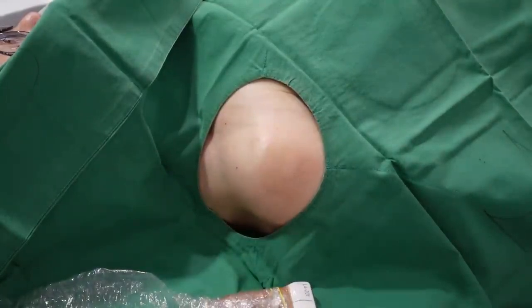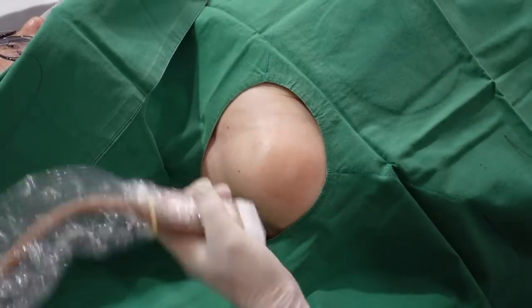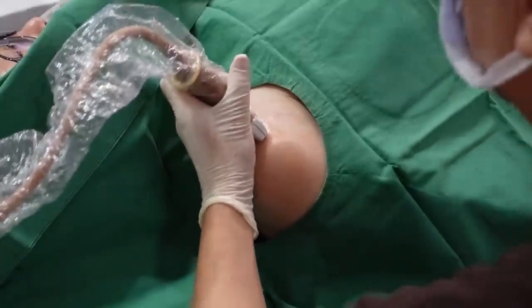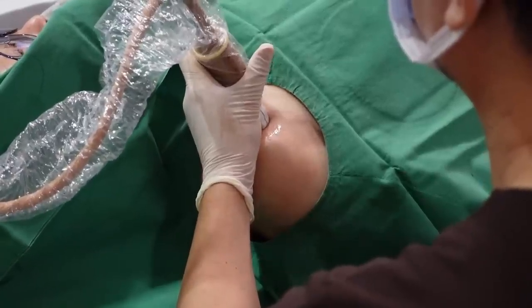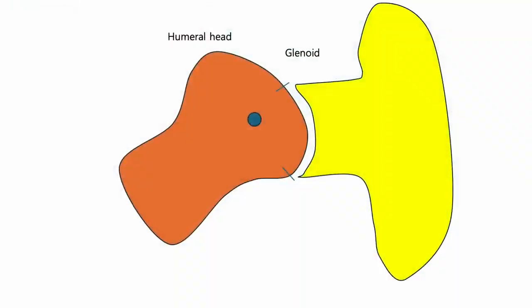I explained my interventional treatment strategy for painful chronic osteoarthritis. It was designed to increase the range of motion by dissecting the fascia from the joint margin. Pain relief would be achieved by blocking the sensory nerve and increasing the free movable space to facilitate the joint's gliding mechanism. Once more, I will briefly describe the gliding mechanism of the glenohumeral joint.